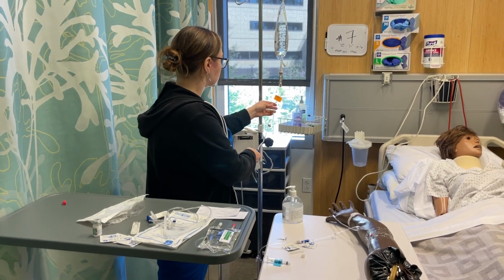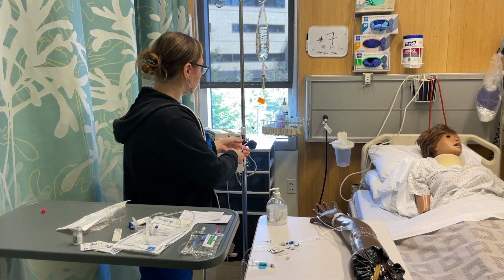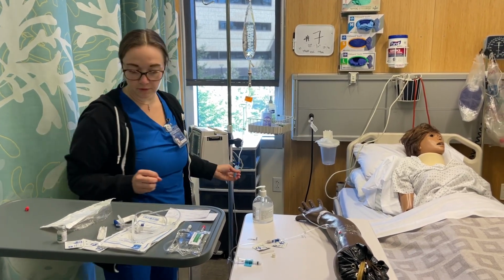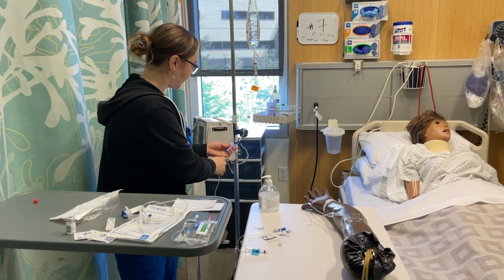Because the line is kinked, it should be going. It would be at 5 drips per minute. 5 drips per 15 seconds. Okay.